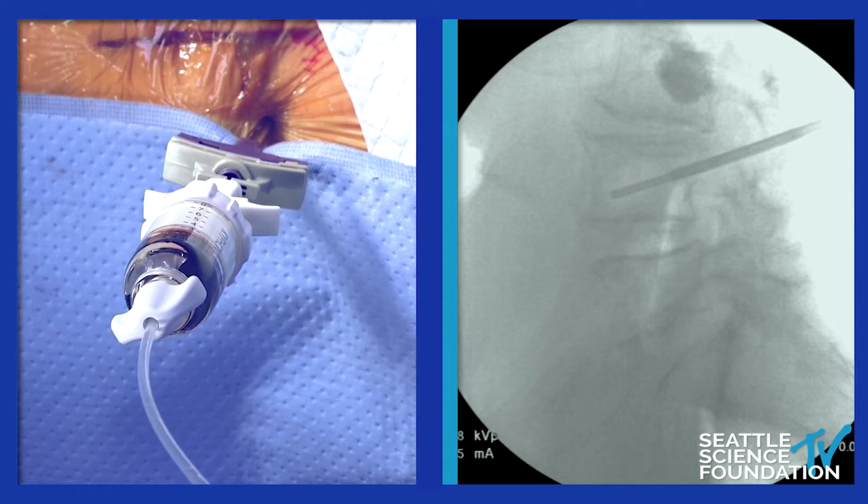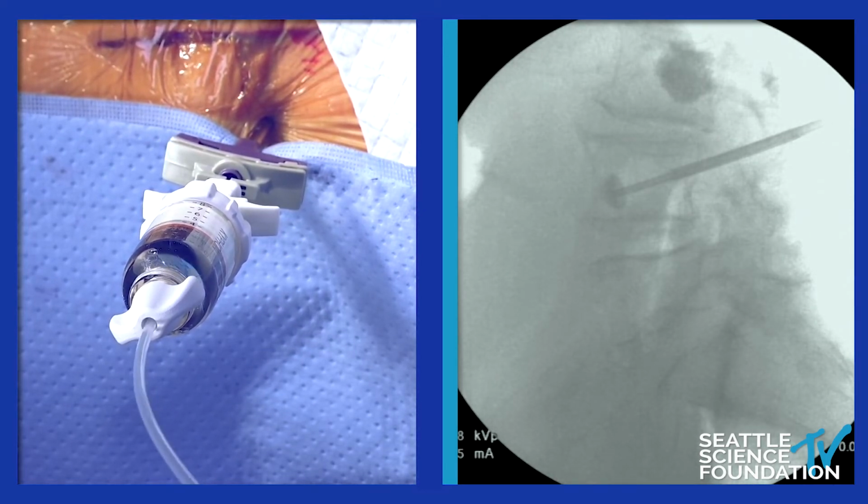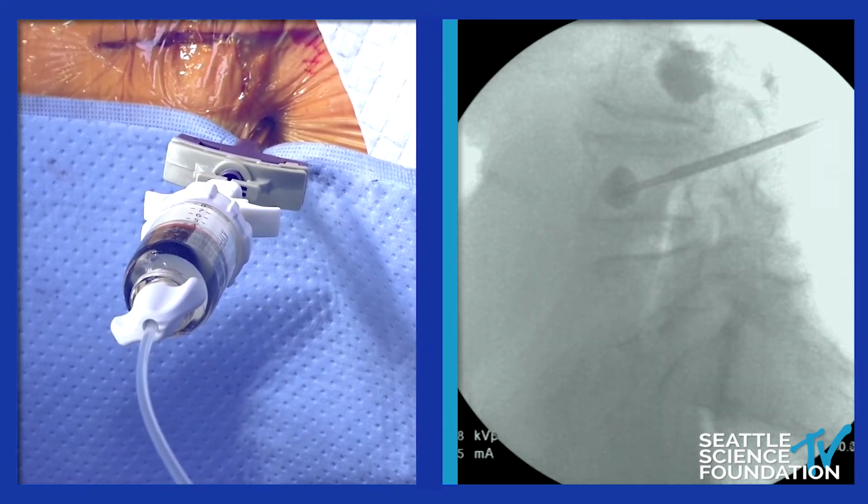Of course, you check the cement itself, making sure it's not sticking to your glove, making sure that the sheen of the actual cement is no longer shiny. A good way is to check, make sure the cement is ready. Let's take a shot. And keep going. Every few seconds. And pulse view of the lateral view of the cement being delivered. Go ahead.